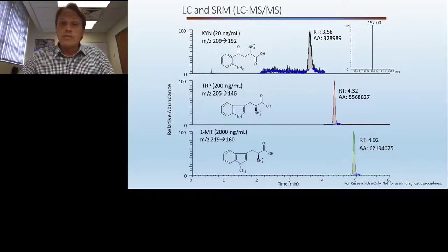And if we add chromatography in this case, we can separate, say, two other compounds or metabolites related to tryptophan. One is kynurenine, which is a downstream product of tryptophan through IDO metabolism, and is often measured as a way to monitor the immune system. It elutes at an earlier time than tryptophan. The later one is a drug that has been studied to alter the immune system, called 1-methyltryptophan, or 1-MT. So in this case, we can monitor this drug, 1-MT, and then two metabolites that might be altered by that drug, to get a general idea of how the body is reacting in that given instance.